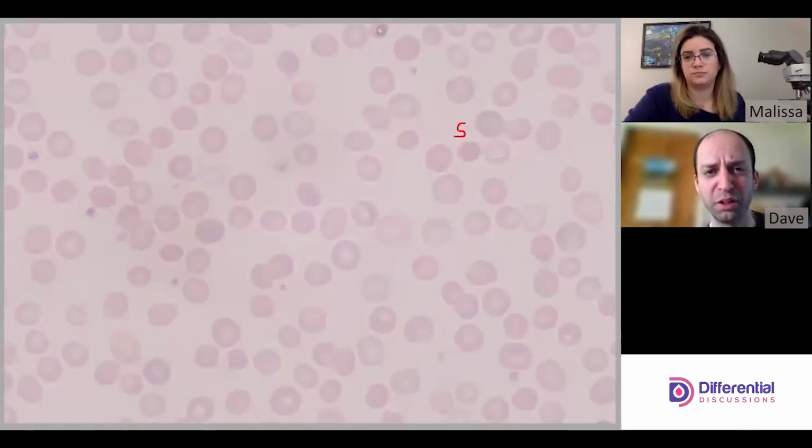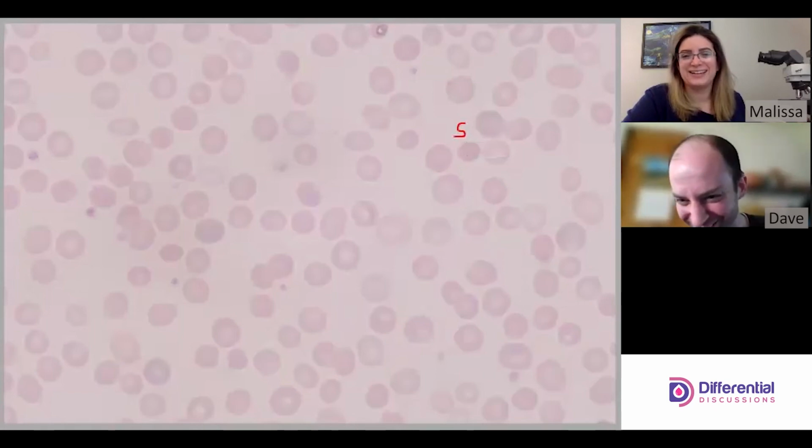My label always goes where I don't want it to go. Thank you for cleaning that up. A really good spherocyte, right?